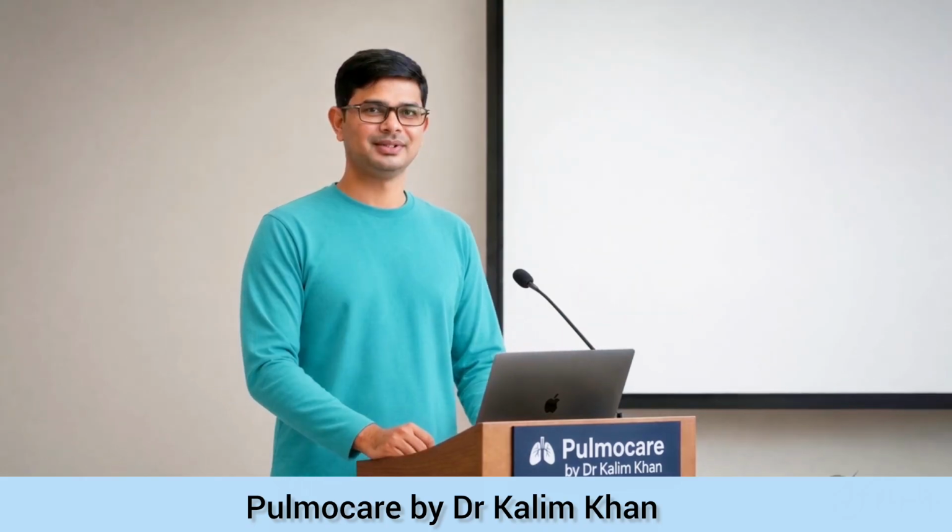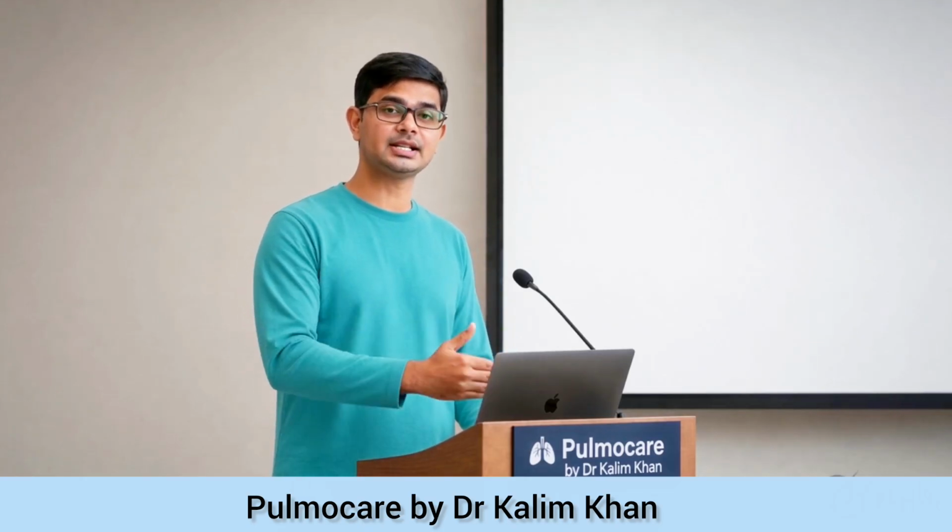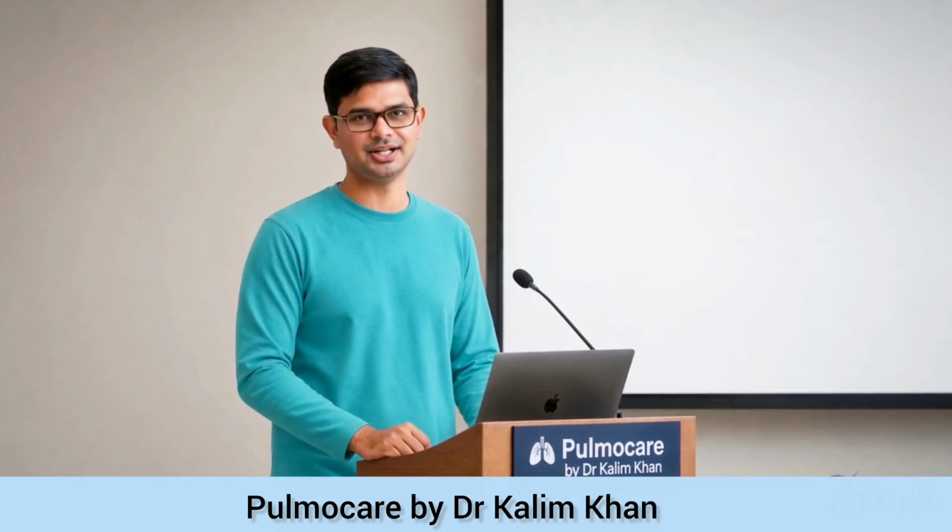First is the gas supply. Most ICU ventilators receive two major gases, medical air and oxygen. These gases usually come from the hospital central pipeline system. Backup cylinders may also be available. The ventilator mixes these gases according to the selected FiO2 and delivers the required gas mixture to the patient. Therefore, before starting ventilation, always make sure that the oxygen and air supply are properly connected and functioning. An interruption in gas supply can become a life-threatening emergency in a mechanically ventilated patient.